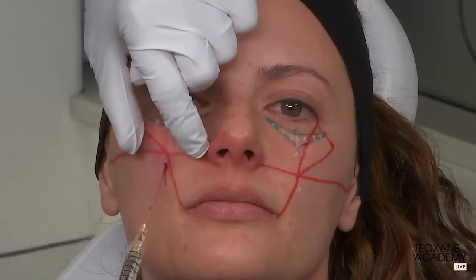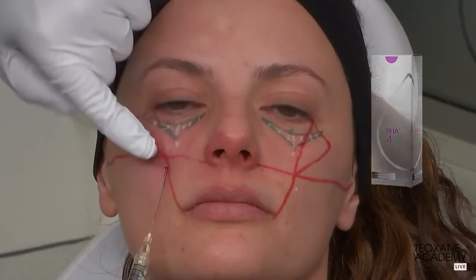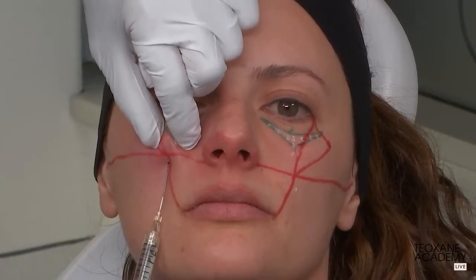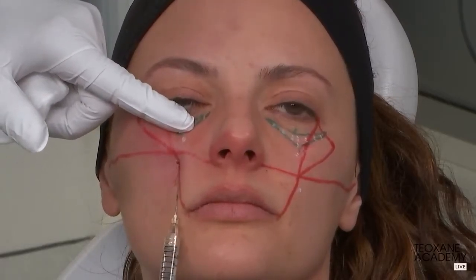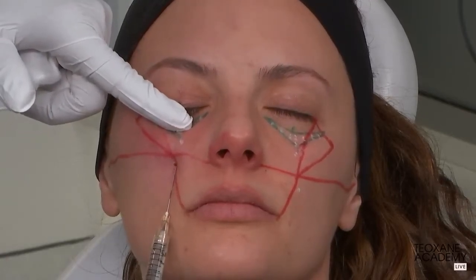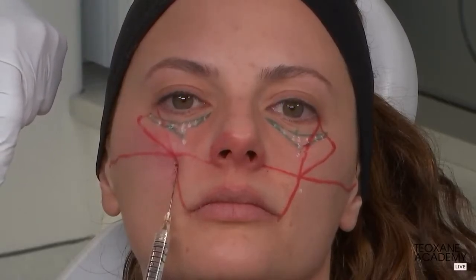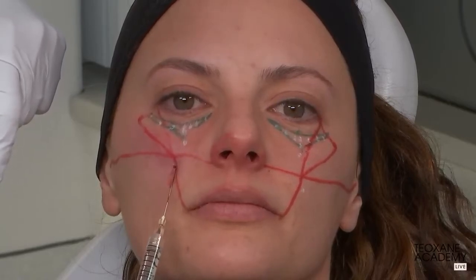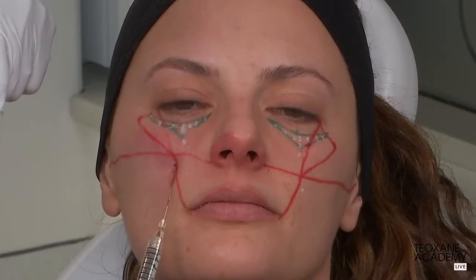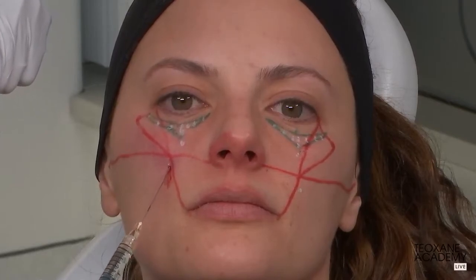Then I go to the apex of the V deformity, where I do the same thing, glide superficial. By doing so, I pass superficial to the infraorbital artery, so totally safe. But then past the orbital retaining ligament, right there, below the orbital rim, because I can feel it with my non-dominant hand, I deliver 0.02 of product on the uppermost point, then 0.05 right at the apex, and then 0.1, a macro bolus, down below to provide support.